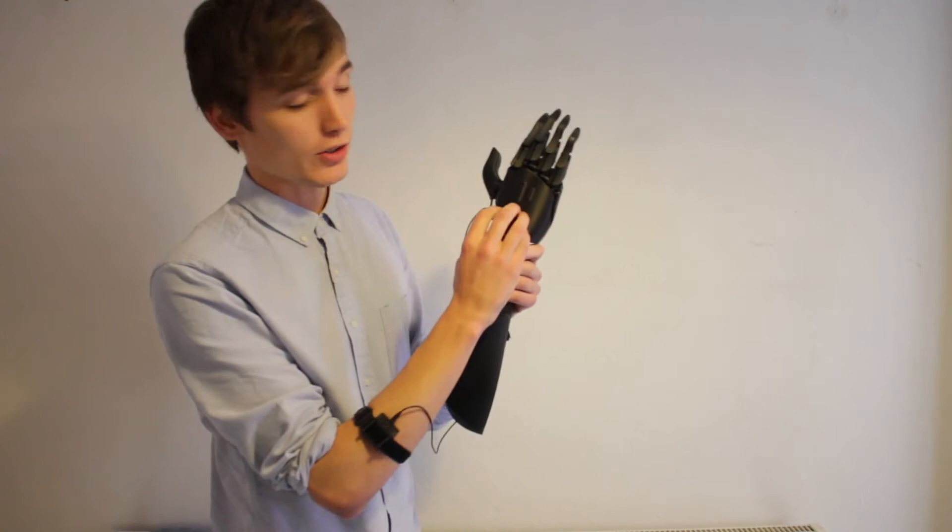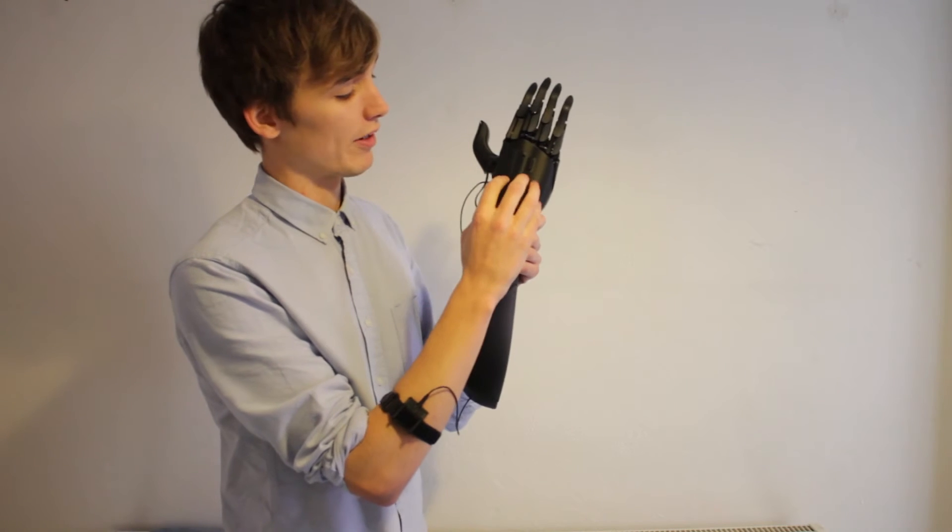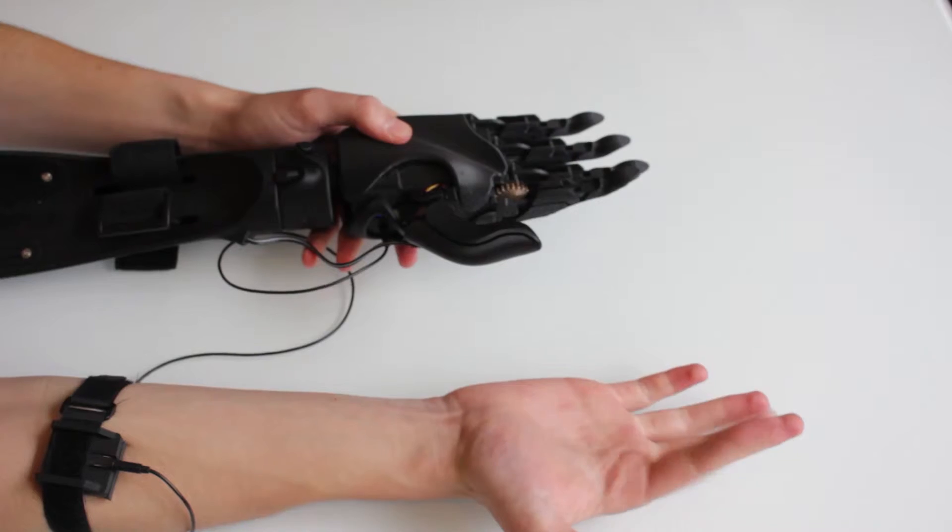All of the electrical components at the moment — the Arduino micro, the circuit board, everything — are all inside here. So we're going to take this out and put it into the forearm.